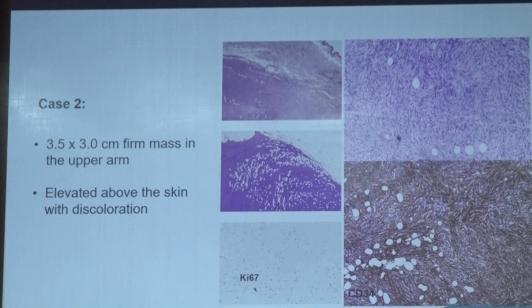So the lesion has to be confined in the dermis, or the lesion has to be confined within the subcutaneous fat, or maybe the lesion is encroaching from the dermis to the subcutaneous. All these lesions like benign fibrous histiocytoma, which is also known as dermatofibroma, dermatofibrosarcoma, all these lesions have an overlying skin.